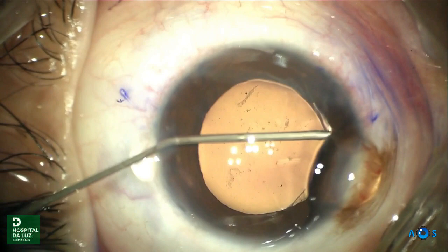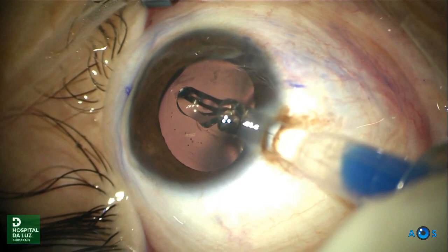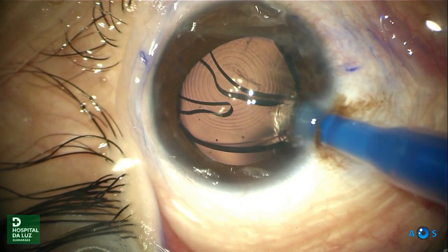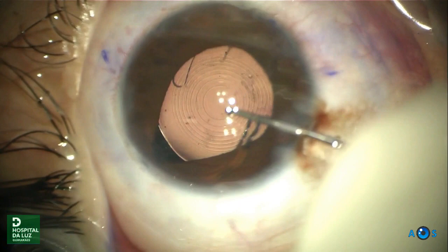First, we injected viscoelastic in the anterior chamber and behind the iris. Then we placed the injector inside the eye and injected the lens slowly, so the leading haptic is placed behind the iris. Then we rotated the lens, so the trailing haptic is also inserted in the sulcus.